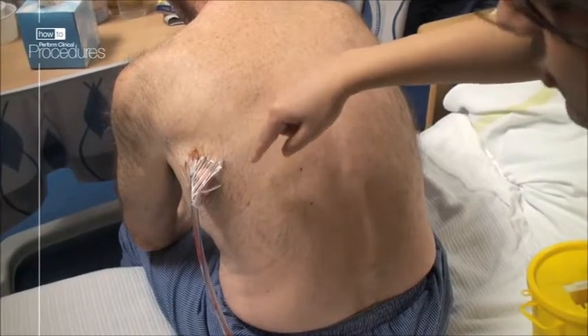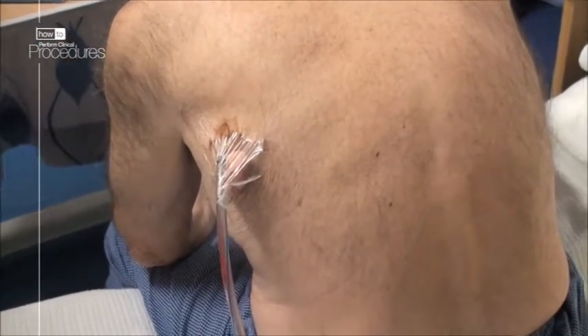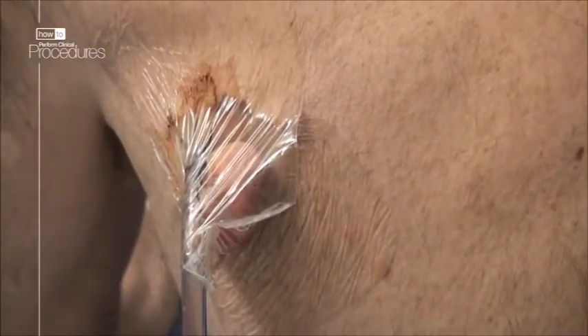You can see the drain here is situated in the fourth intercostal space in the safe triangle. It is held in place with a suture and a small dressing with a transparent tegaderm so that it is easy to inspect the drain site.